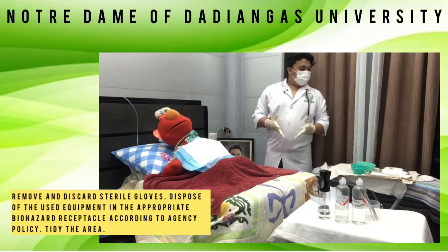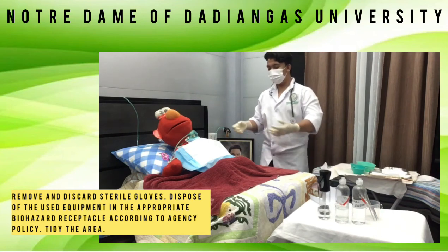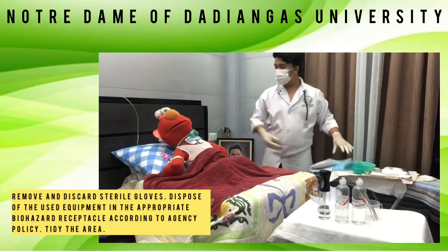Remove and discard sterile gloves. Dispose of the used equipment in the appropriate biohazard receptacle according to agency policy, and tidy the area.